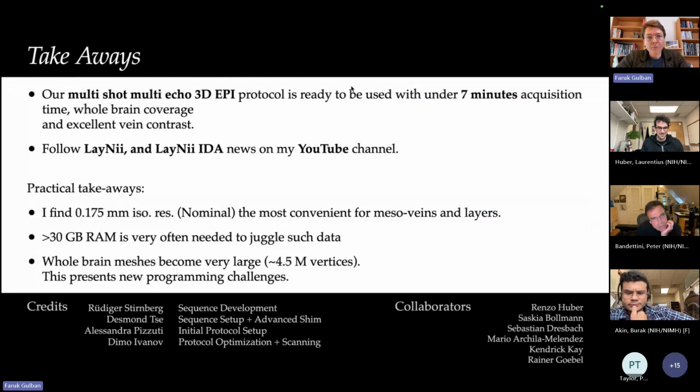So just my final takeaways. Our multi-shot, multi-echo 3D EPI protocol is ready to be used.